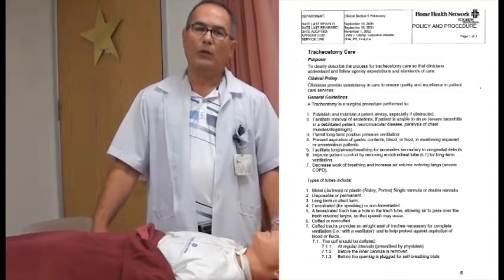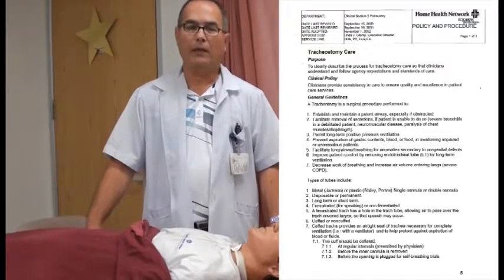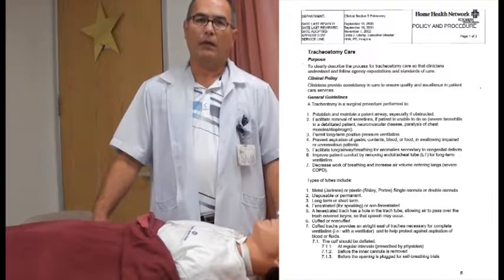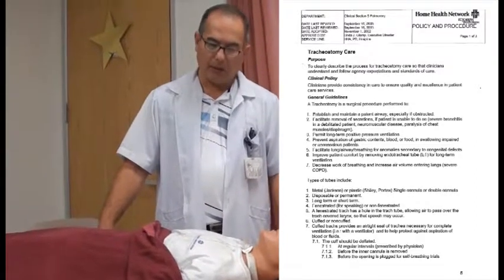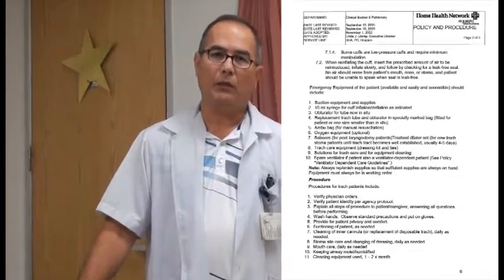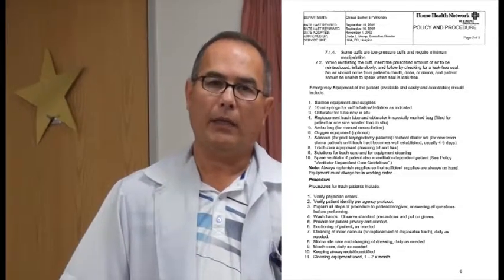First of all, before we do any type of procedure, we want to make sure that we do have a doctor's order and that it should be part of our care plan. This procedure should be done every day, and we should be teaching the patient or the patient's family and caregiver how to do the tracheostomy care on a daily basis.